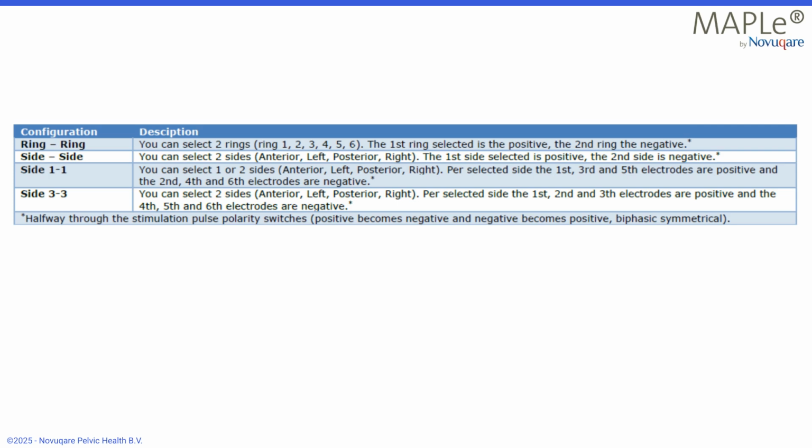If stimulation does not produce contraction, possible denervation, stimulate active areas to reach less active ones indirectly. Adjusting ES sensitivity. If ES feels too sharp, reduce phase duration and gradually increase it or raise frequency. If ES is not strongly felt, increase phase duration or adjust frequency.